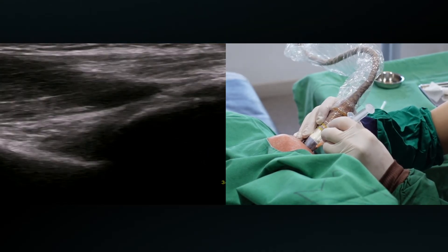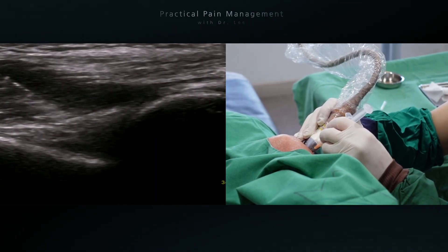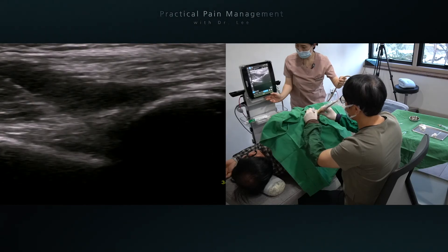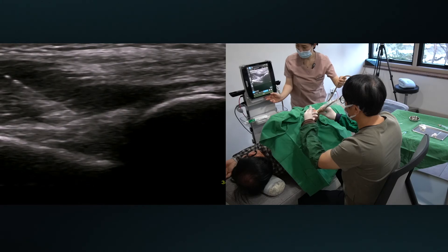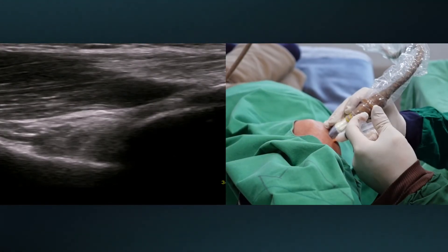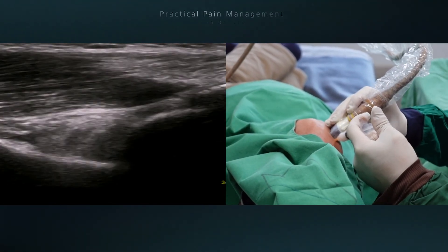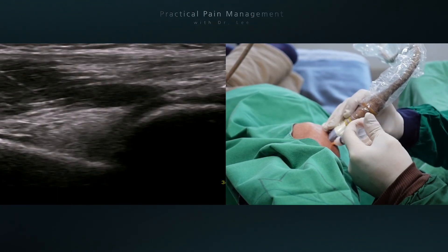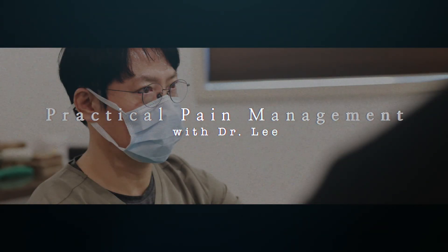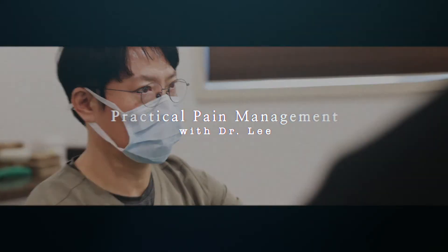Many movements require the non-dominant hand to hold and control the needle. In my case, the left hand is the non-dominant side. So we have to train our non-dominant hand control to make a more meticulous approach.